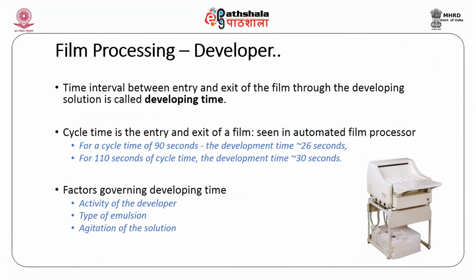The next factor is time, which is important. We talked about temperature, time is also important. The time interval between entry and exit of the film through the developing solution is called developing time. Cycle time is another thing, which is the entry and the exit of a film. This is usually seen in an automatic film processor. For a cycle time of 90 seconds, a developing time is about 26 seconds. For 110 seconds of cycle time, developing time is about 30 seconds.